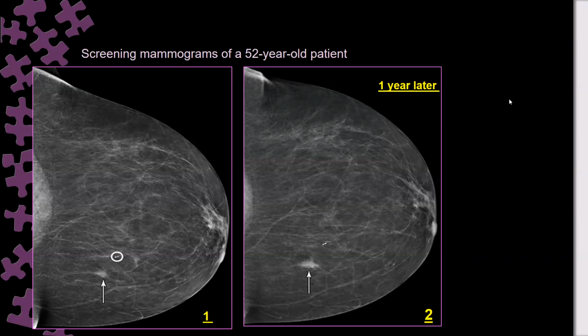What do you expect this lady has? She most likely had a marker, she had already an intervention. Breast tissue marker. Okay. Yes. What do you most likely think the previous biopsy result was? Most likely it's malignant, I think. And the patient disappeared? You mean they received treatment?